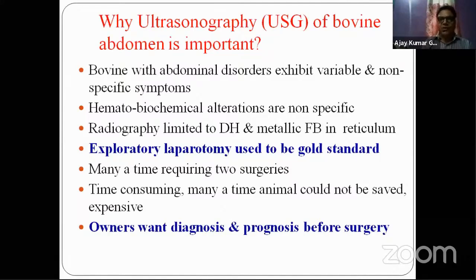So, with that background, we'll move ahead today and discuss why ultrasonography of bovine abdomen is important and what are the normal and abnormal things which we should look for while performing ultrasonography.